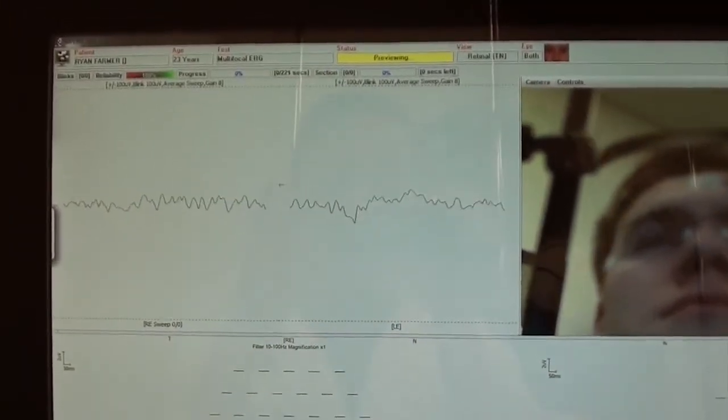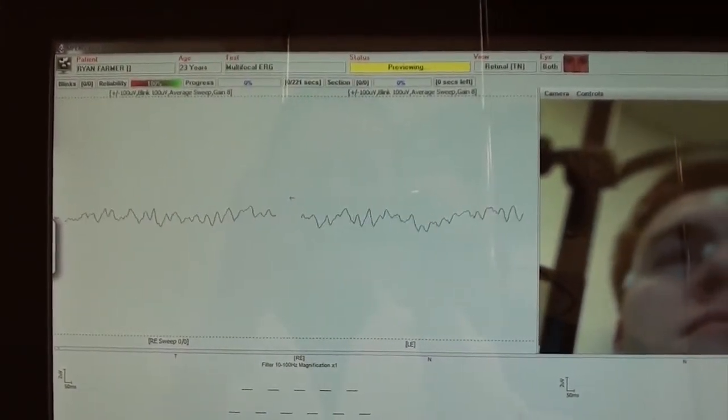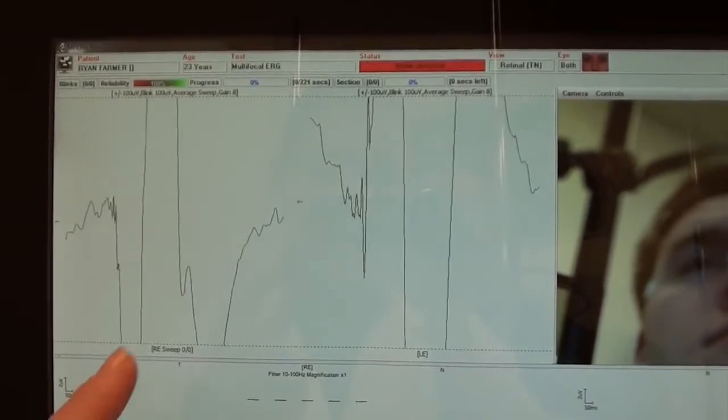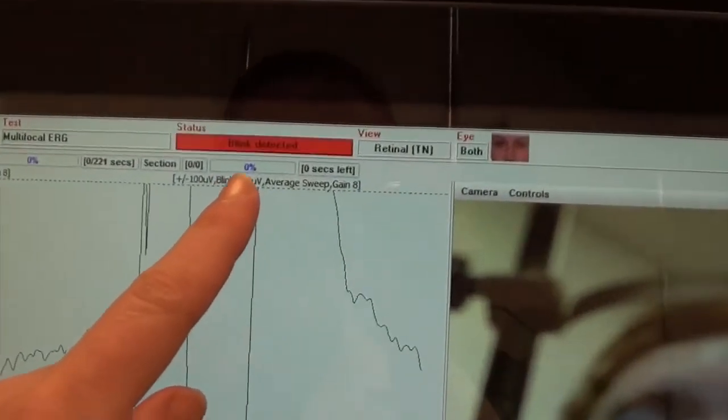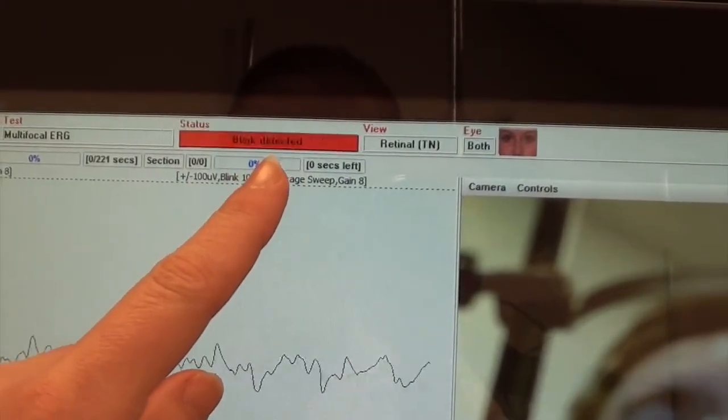The signal looks clean. If the patient blinks, we will see that coming through and we will be notified that a blink is detected.